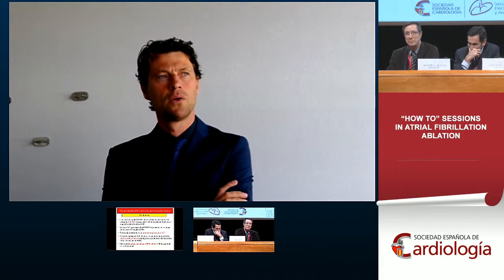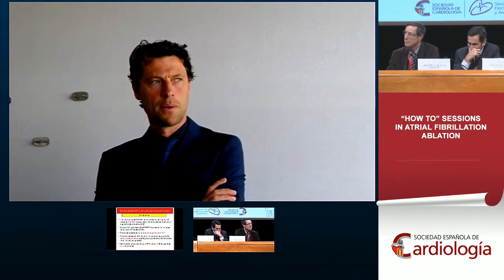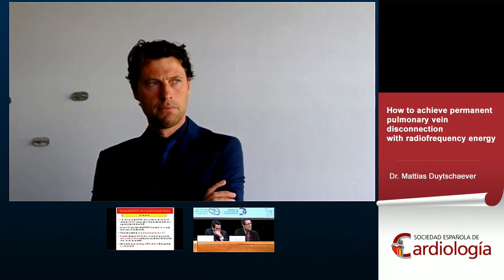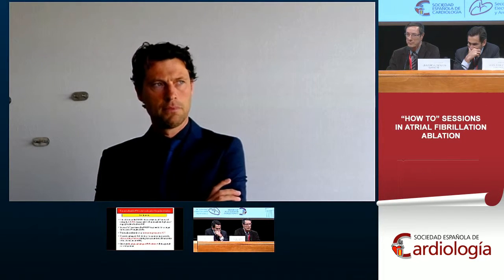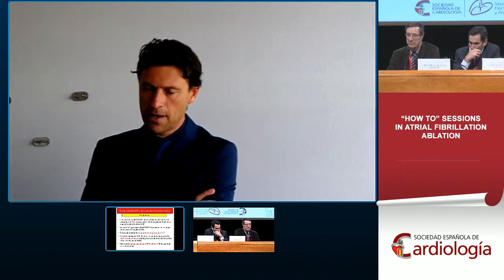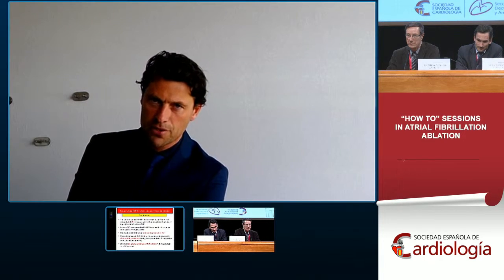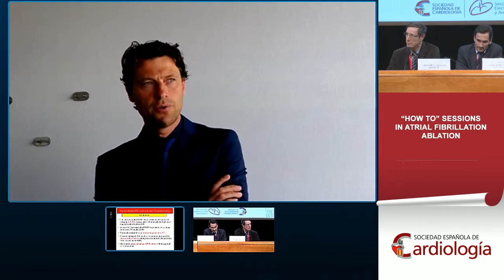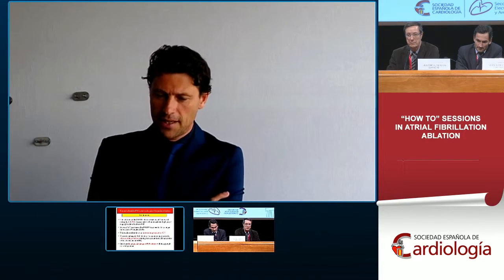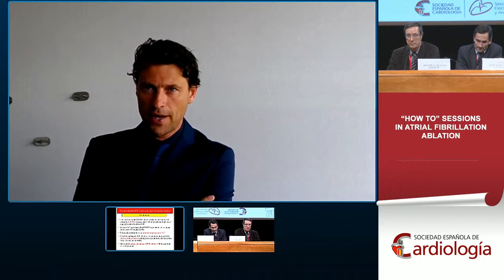So why does the close protocol include burning close to the vein? What's the rationale behind that as opposed to going farther away from the vein? Why is the protocol including that? Yeah, I will tell you, Andrea, because that is how I have been doing ablation from the start. I always follow the electrograms. But don't think that this is a tight circle. It's 12 centimeter on average.